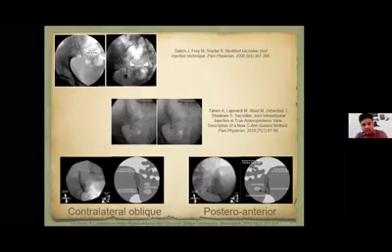In this first figure, you can see the medial lip of the joint, the medial joint line. We use a curved needle and try to hit the medial side of the joint line, then we tilt the curve of the needle a little laterally and enter the joint. Then we can move it a little cephalad, and then we can inject the drug. That is the usual technique that we do.